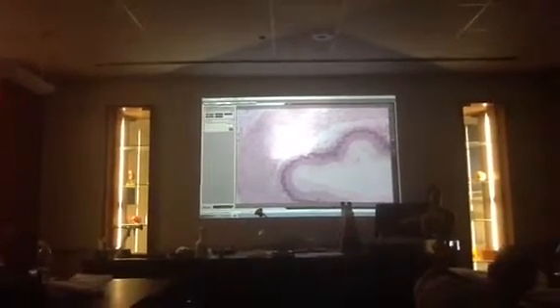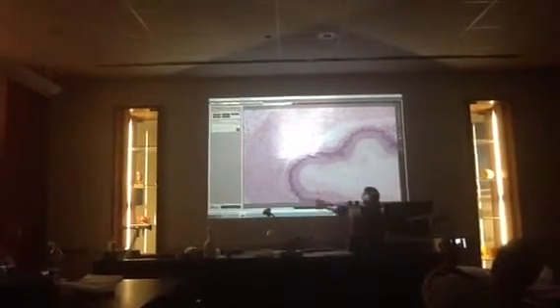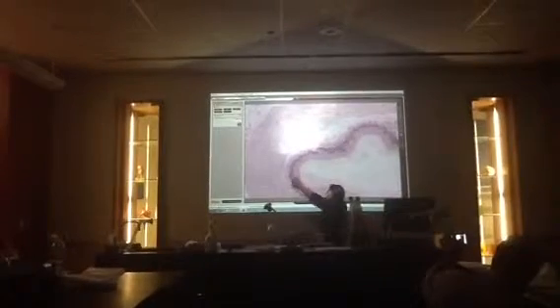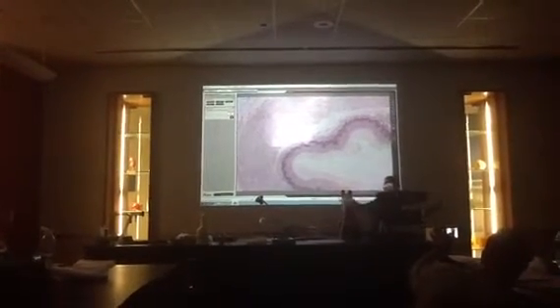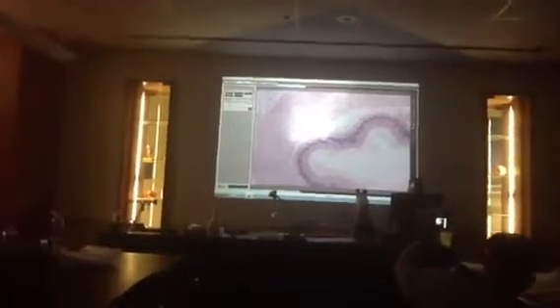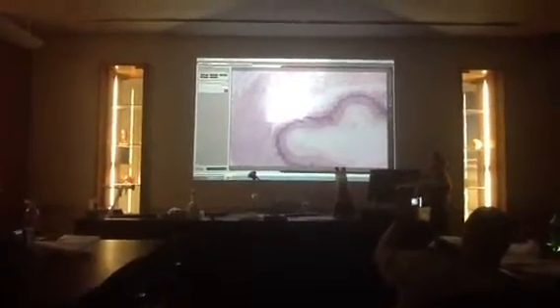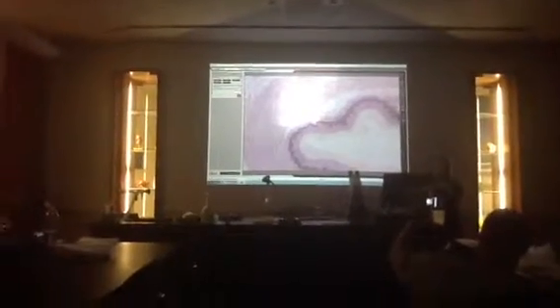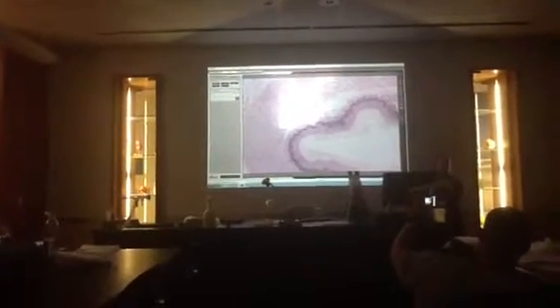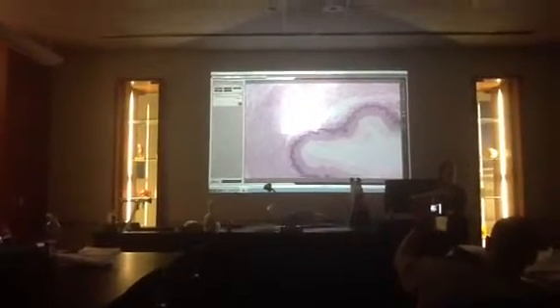So that darkest part is the stratified squamous? Yes. All of this is stratified squamous, one of many layers. And then the lining right after it? The lamina propria, and then the muscularis mucosa. All of those three structures make up the mucosa layer. So if it's asked for what layer is this, and a choice is mucosa, that's what you choose.